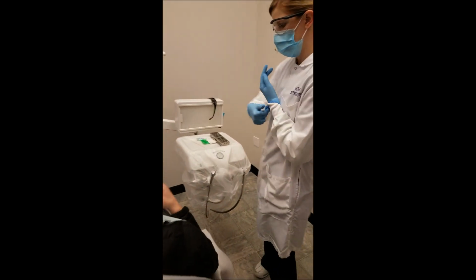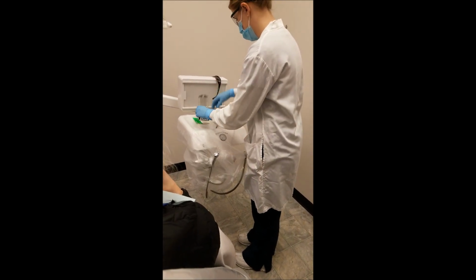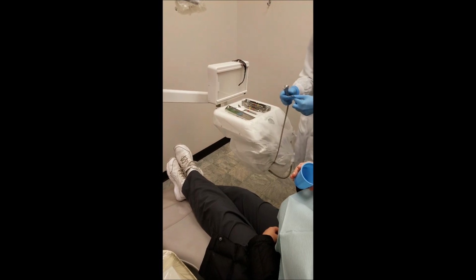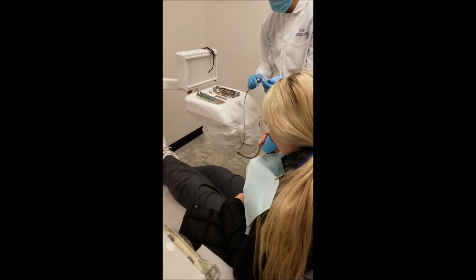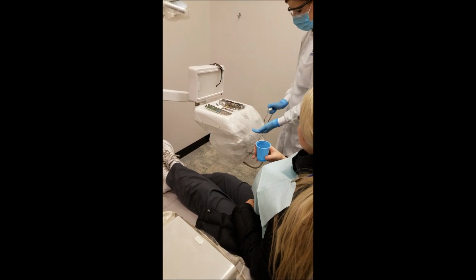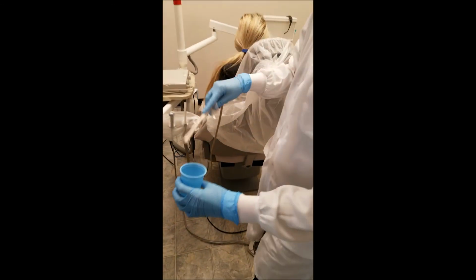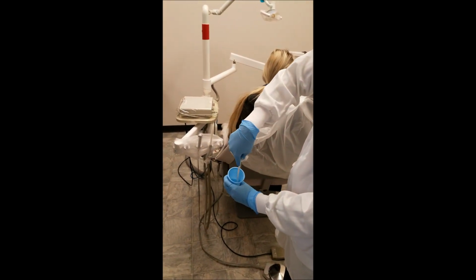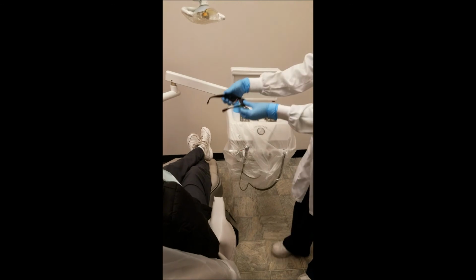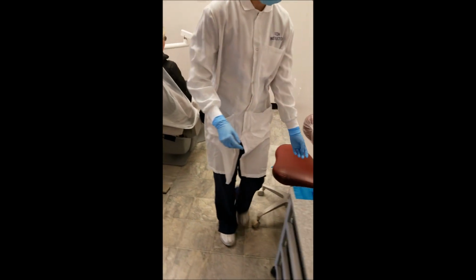Once she is all gloved up, she can touch her instruments, so she will set them up, including arranging the air water syringe. And then she will suction the antimicrobial rinse with the saliva ejector, and then return the cup to the tray to use for discarding debris during the appointment. She will provide the patient with protective eyewear. Patient PPE should never leave the operatory. And then she will utilize the barrier technique for recording entries during intraoral procedures.